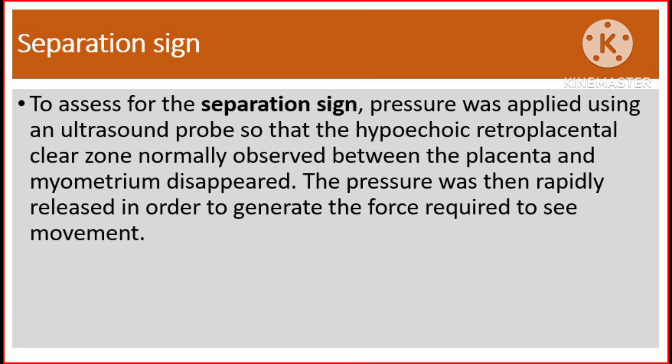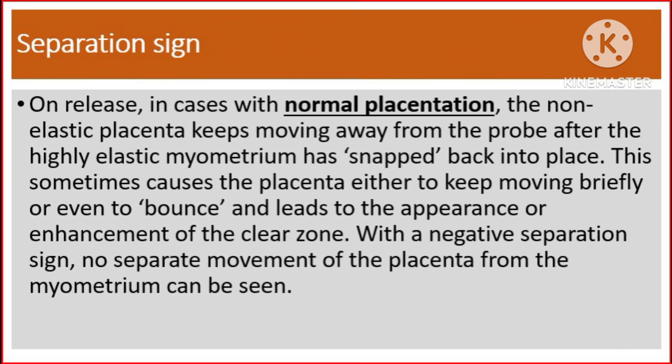To assess for the separation sign, pressure was applied using an ultrasound probe so that the hypoechoic retroplacental clear zone normally observed between the placenta and the myometrium disappeared. The pressure was then rapidly released in order to generate the force required to see movement. On release, in cases with normal placentation, the non-elastic placenta keeps moving away from the probe after the highly elastic myometrium has snapped back into place. This sometimes causes the placenta to keep moving briefly or even to bounce, leading to the appearance or enhancement of the clear zone. With a negative separation sign, no separate movement of the placenta from the myometrium can be seen.